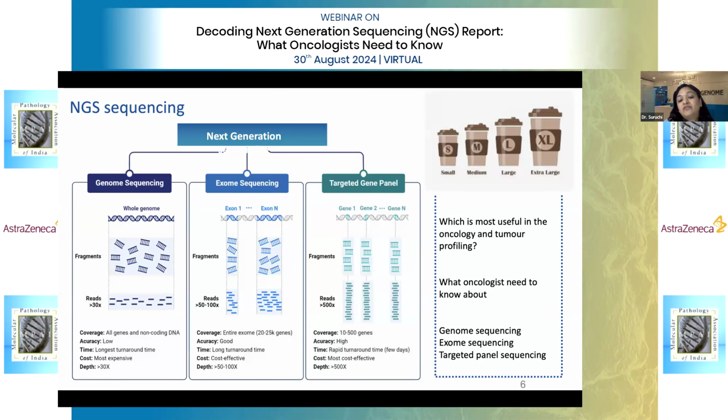They give us good quality on FFPE. If you do larger panels like genome and exome on FFPE DNA, the data quality is poor. Even if we increase the GB of sequencing, we do not get the average depth recommended for calling confident variant calls. So targeted gene panels are sought after, and they should be indication dependent, because in India our objective is cost effectiveness for the patient also. So targeted panels with actionability should be sought after.